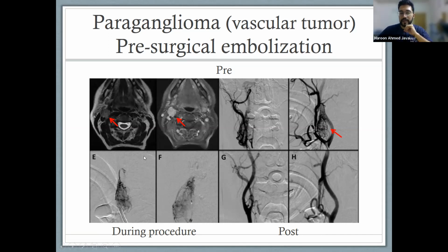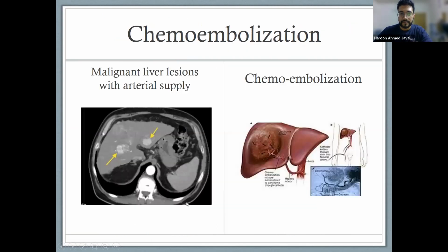So if you have a pre-surgical scan done, it's very easy to localize the pathology as well while you're operating, right? So over here, this shows you pre-scan. Over here, there's a lot of blood supply to this paraganglioma. And then after that, after embolization, when they insert the glue or something that causes clotting or fibrosis over here, there's lack of blood supply. So this area is no longer lighting up. This is pre-surgery, okay?